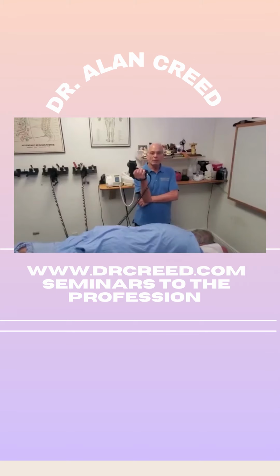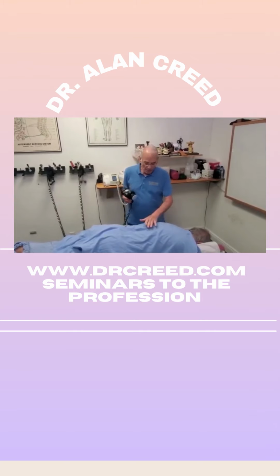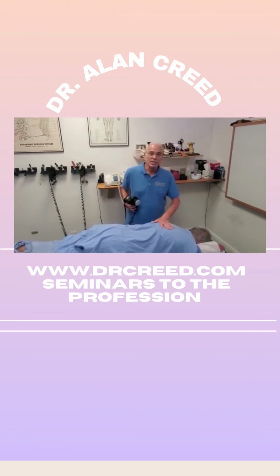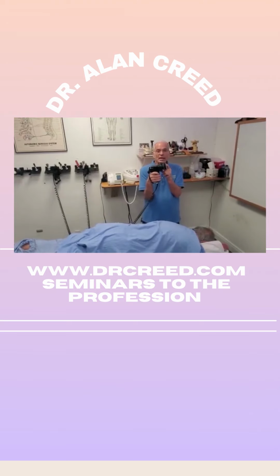So we're going to talk about a vibracussor. This is a unit that has some unique qualities. Vibrators in general are lateral, they go like this, and they're pretty much superficial, which is good. It gets blood in there, and it talks to the muscles, and it wakes things up in a nice way. This is a vibracussor, and as you see, it goes up and down. There is a little bit of sway in it, but mostly it's up and down.